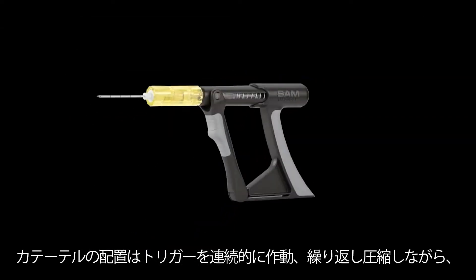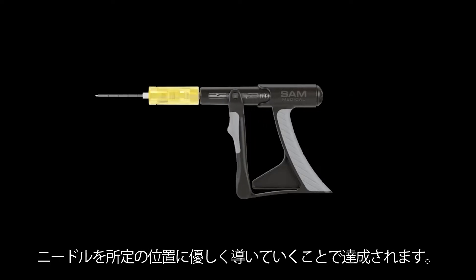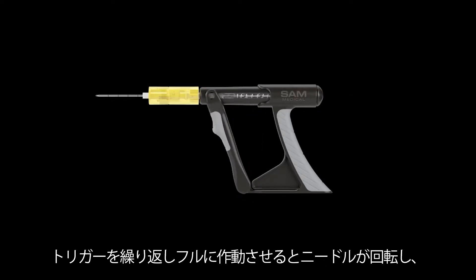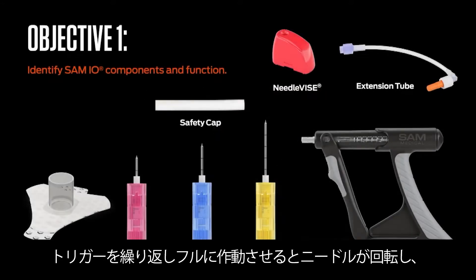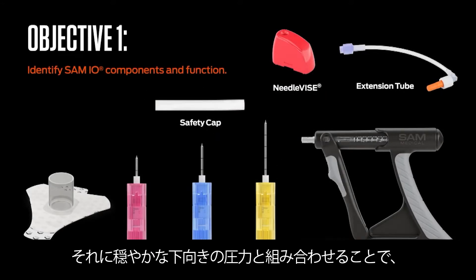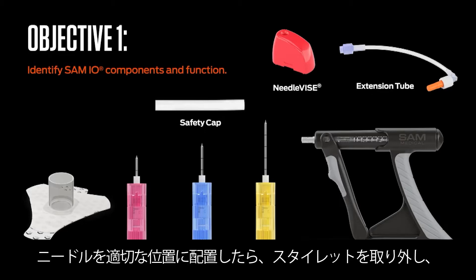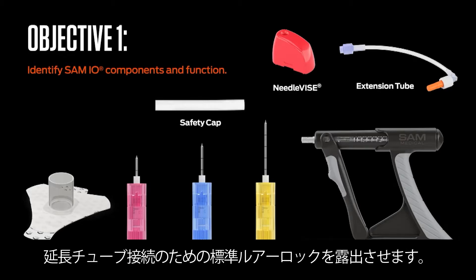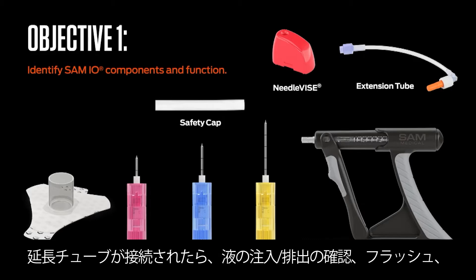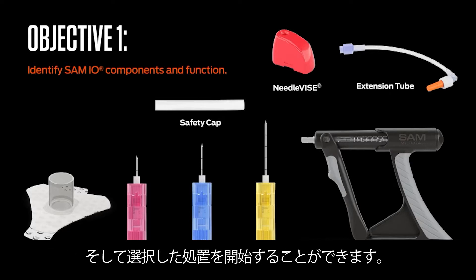The SAM-IO is a manually operated interosseous access system. Catheter placement is achieved by continuously actuating — repeatedly compressing — the driver's trigger assembly while gently guiding the needle assembly into position. Repeated full trigger actuation completes a rotational spin of the needle assembly which, when combined with gentle downward pressure, results in a controlled IO placement. Once the needle assembly is properly positioned, the stylet is removed to expose a standard luer lock for extension set connection. With the extension set connected, aspiration verification, flushing, and selected treatments may commence.